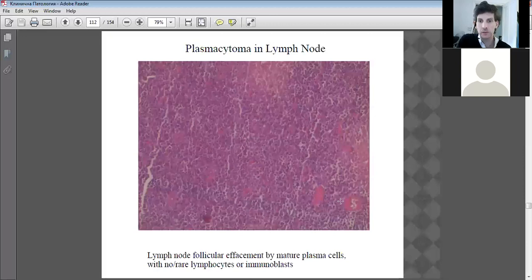Now these patches here are more capillaries, effacement. They're a nice example. There are lots of examples now of plasma cells all over the place. Now, that's of course part of your secondary defense mechanism. And they'll probably be recruited by a tumor necrosis factor secreted by the lymphocytes. Okay.